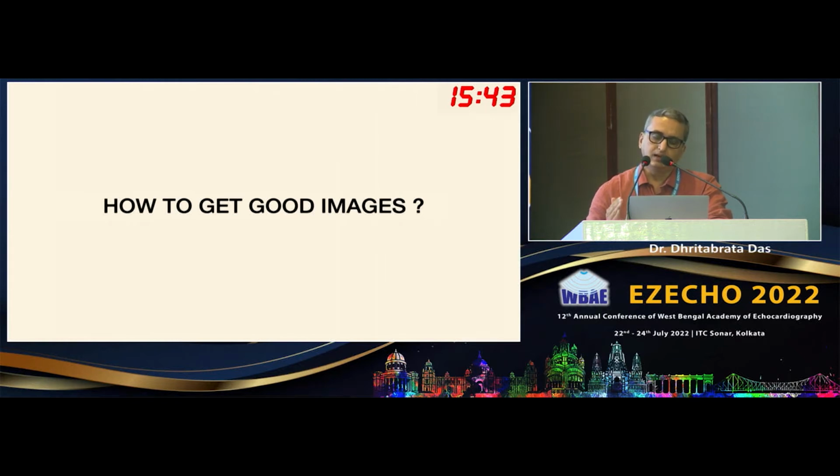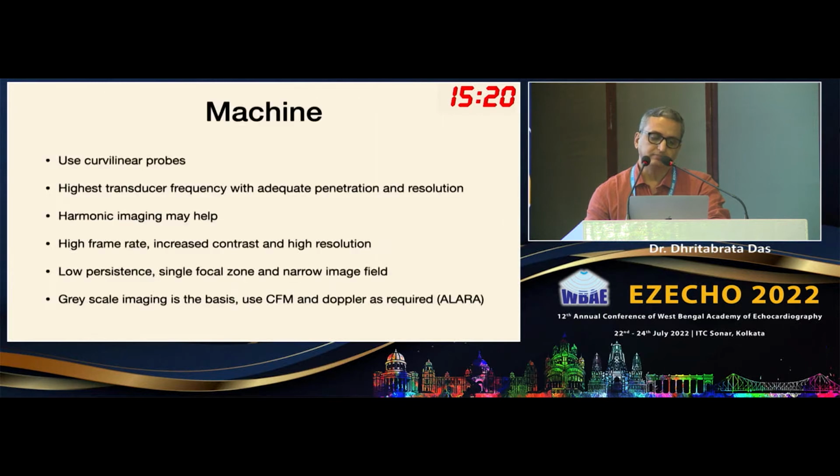Naturally, the technique of getting fetal cardiac images is different from echocardiography in a child or an adult. Those who regularly do fetal ultrasound get much more beautiful images compared to us. So it is our duty to train ourselves to get more beautiful images.